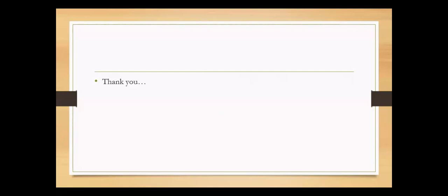Yeah, thanks for that. I think you're quite right. There definitely is no evidence to look at whether you can do a micro ultrasound, and they use microbubbles as well to look for lesions. It only helps you when you're actually doing it real time and doing a biopsy.